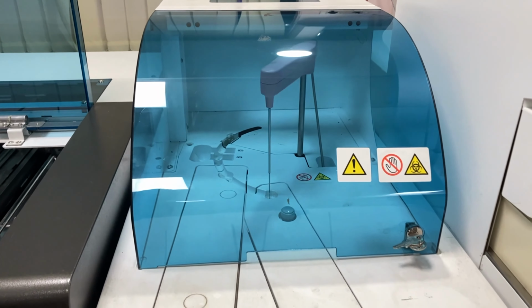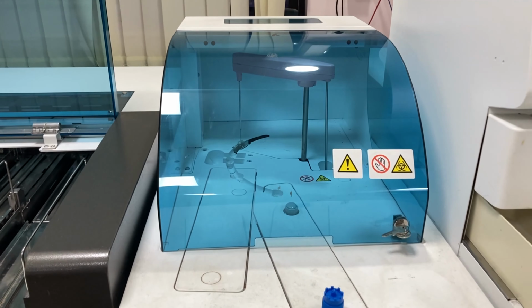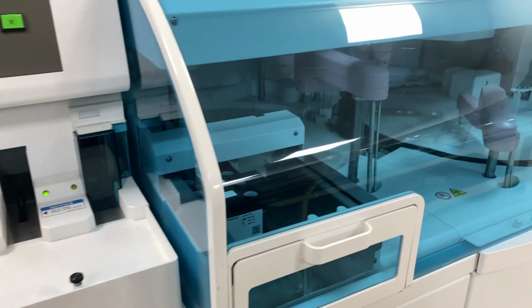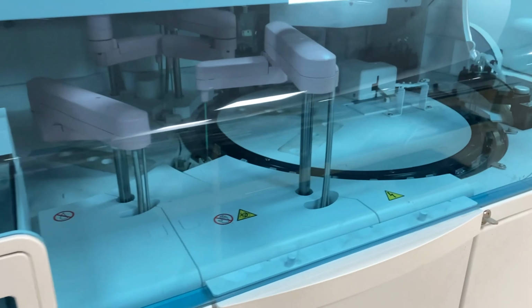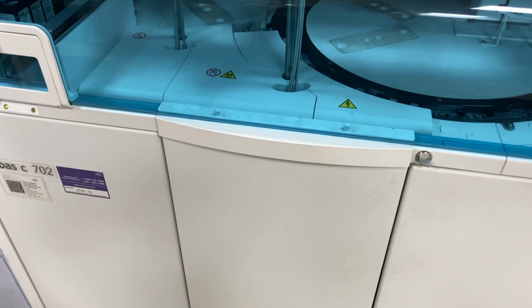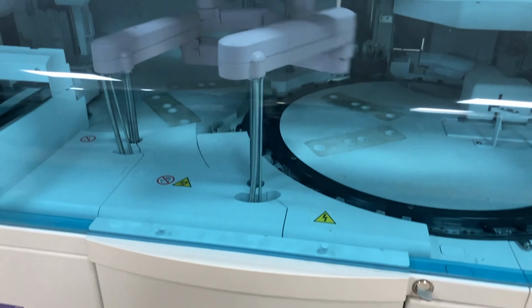Various quality control measures are in place to ensure the accuracy and precision of the results generated by the autoanalyzer. These quality control measures are such as the internal quality control, external quality control, and frequent calibration as and when required.